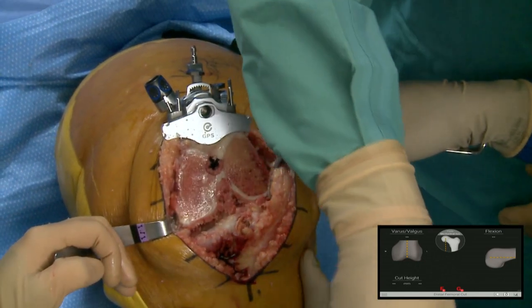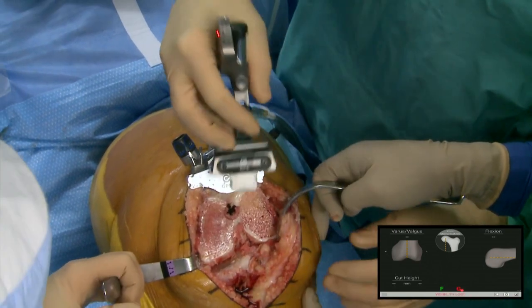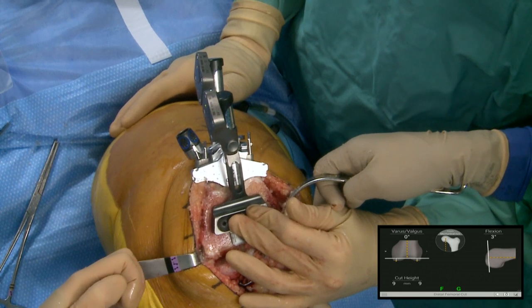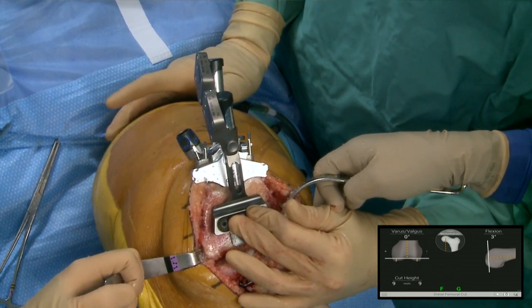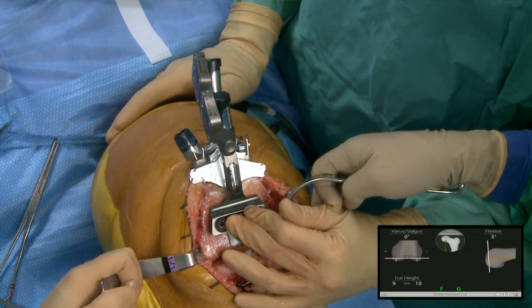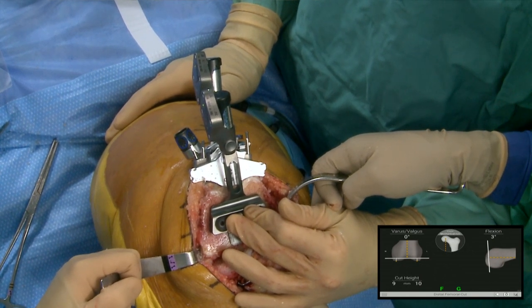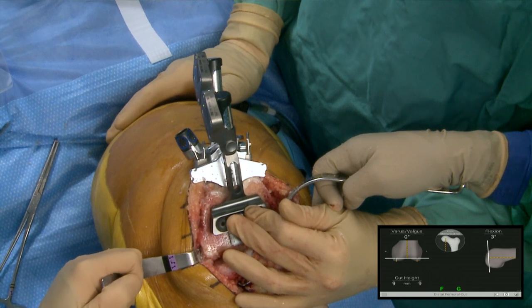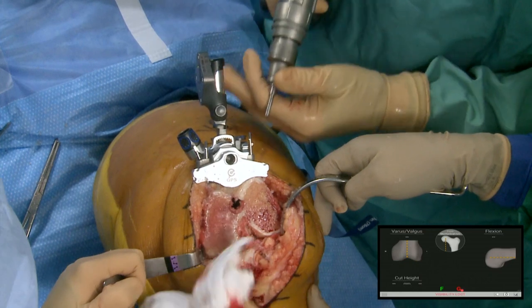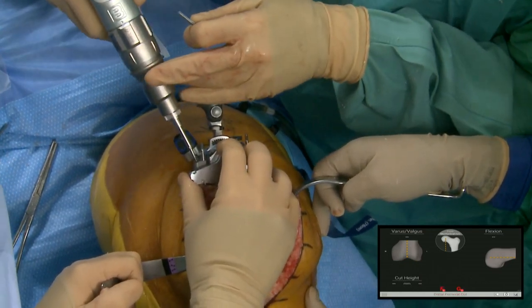We put the tracker back on the femoral guide and check our cut. We're good on the mechanical axis, and the saw not surprisingly skied just a little bit — we went back to three degrees on our flexion. I'm not going to go for zero-itis; I'm going to take that and say I'm already better than I would have been. Now we can take the tracker off, take the block off, and move on to the tibia.